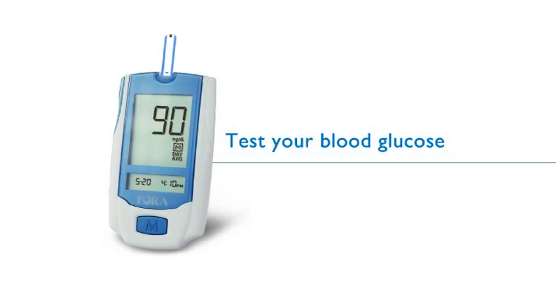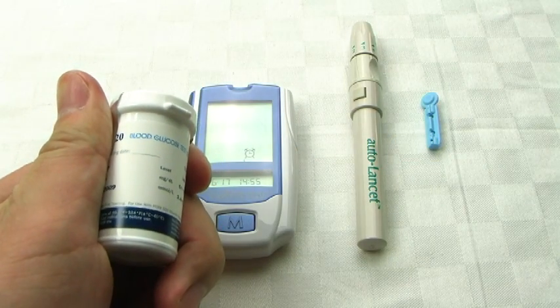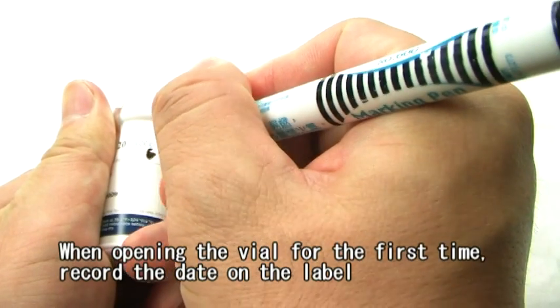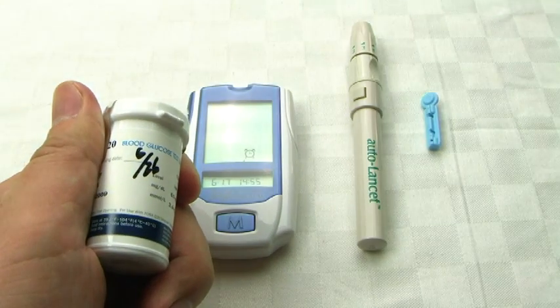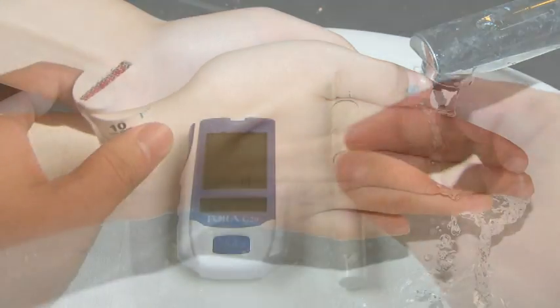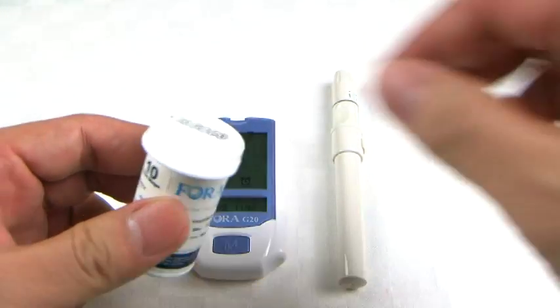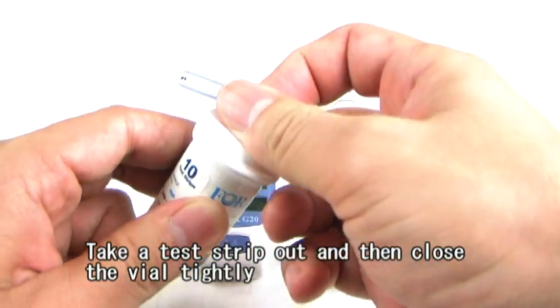Test your blood glucose. When opening the vial for the first time, record the date on the label. Wash and dry your hands thoroughly. Please tear off the security label. Take a test strip out and then close the vial tightly.